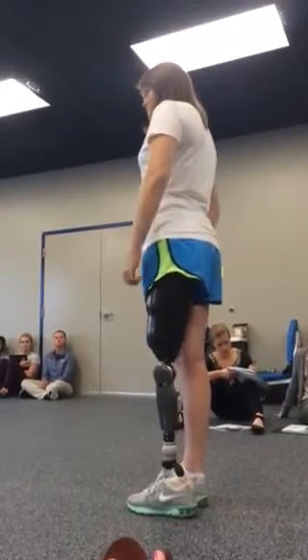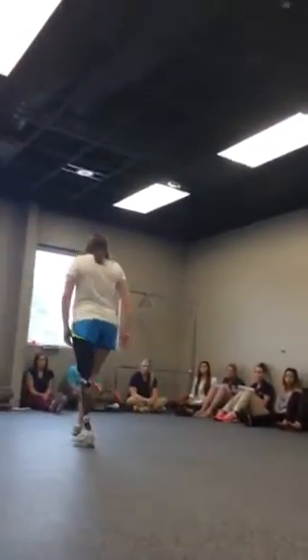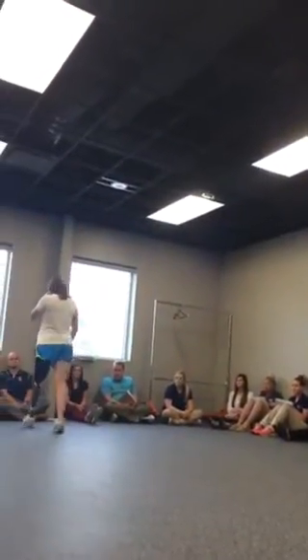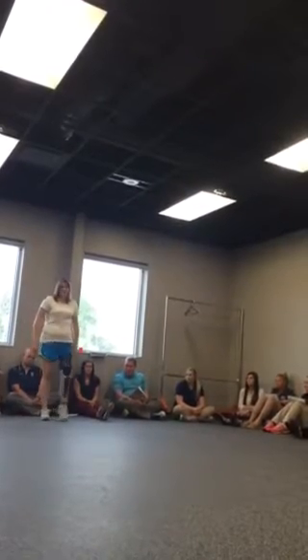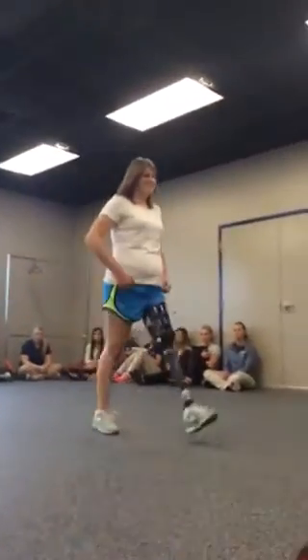All right, so do you mind walking back and forth a couple times? Click in there for a second. Is that you in the socket? That's good.